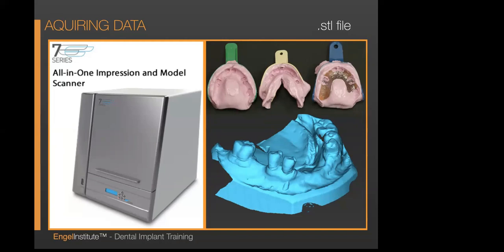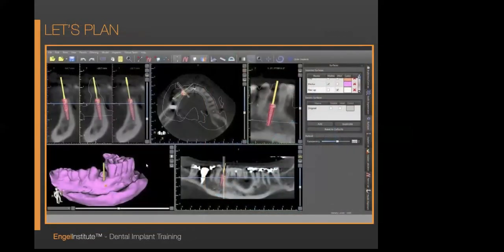And we can actually scan the impression and get an inverse model without any stone. So those are the three ways. But ideally, we want to make sure that we capture the information to then get over to them. All right, so what happens next?